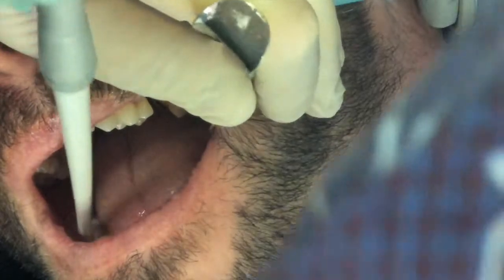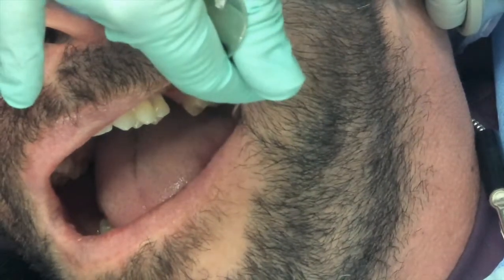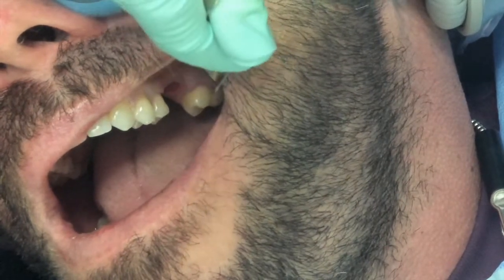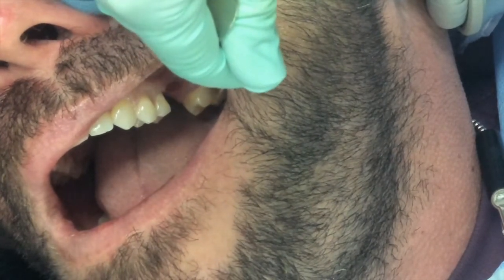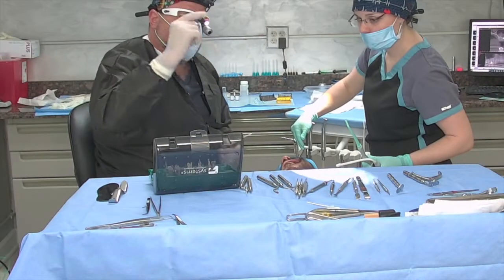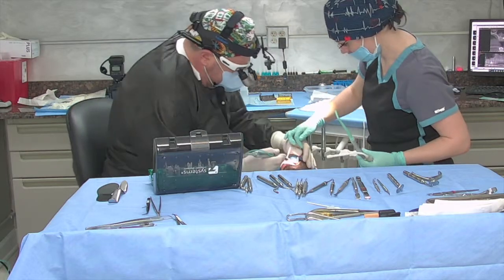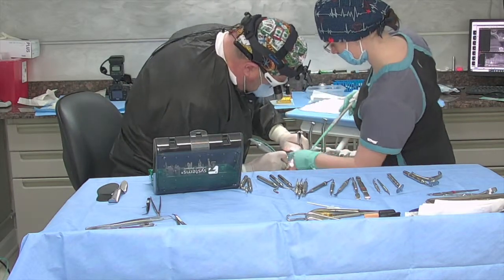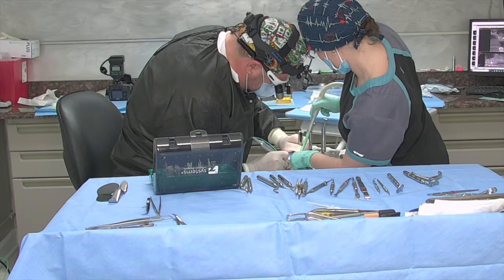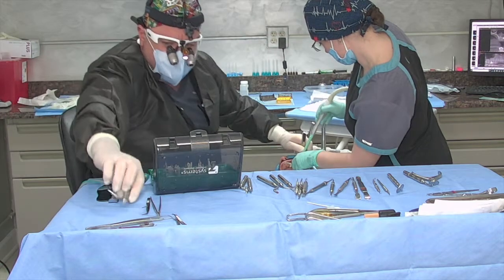So now what we're going to do is we're going to go back. Hold that. And I'm going to go back to the smaller diameter, okay? Back a little bit to the 2.8. I'm going to use this to go a little bit higher up. So here's 8. Now, did you see that? That just took it a little bit more. So we went through the septum with the smaller drill, with the suction in the site.